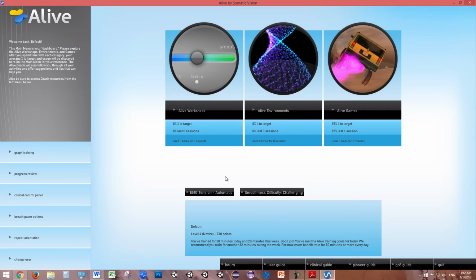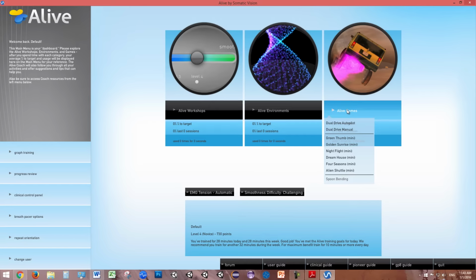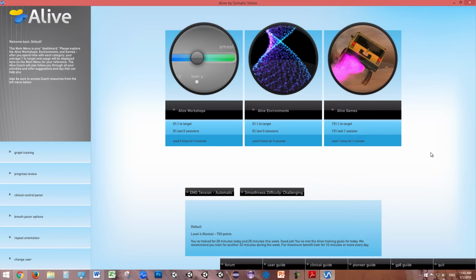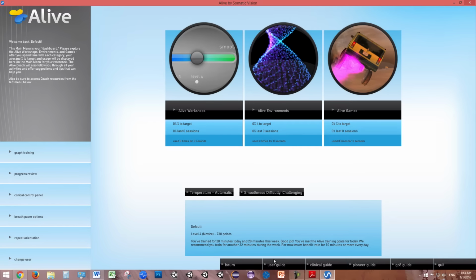On the Alive main menu, you can set the feedback here. This feedback selection is where you choose what feedback is used for Alive environments and games. For example, if you want to train dual drive with temperature, you would set the feedback to temperature manual or automatic, and then from Alive games, choose dual drive.